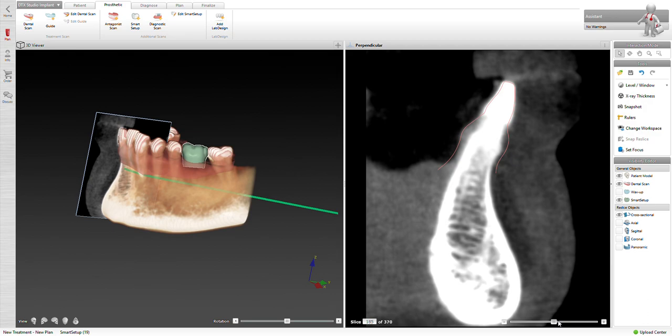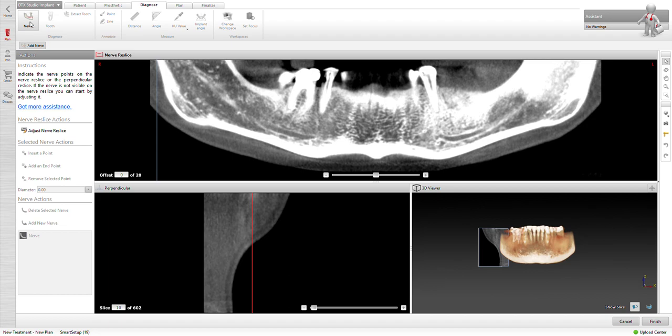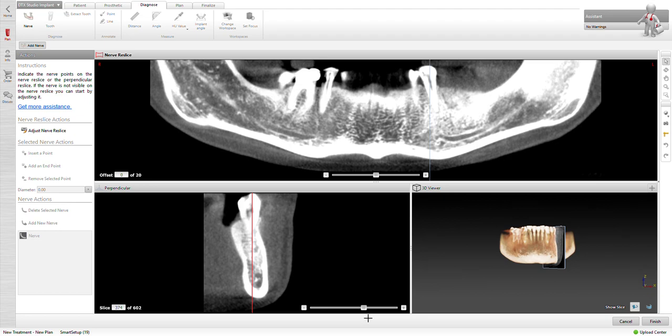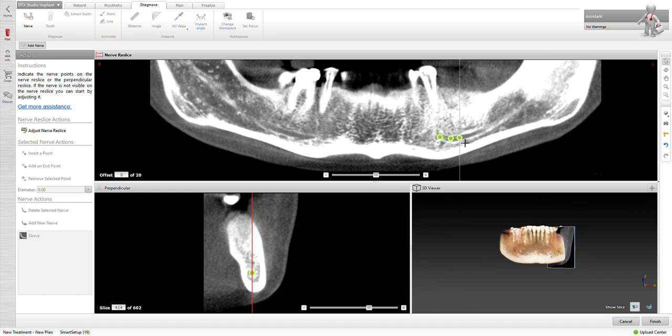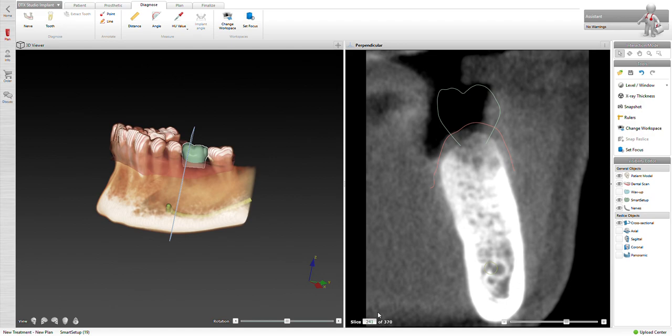Alright, hit finish. We'll rotate over, reslice. We need to go ahead and map out our nerve, so we go to diagnose nerve. I want to move the reslice curve over, or reslice over. There we go, so we can identify on the lower left screen. Then we can go ahead and map our nerve and the mental foramen.